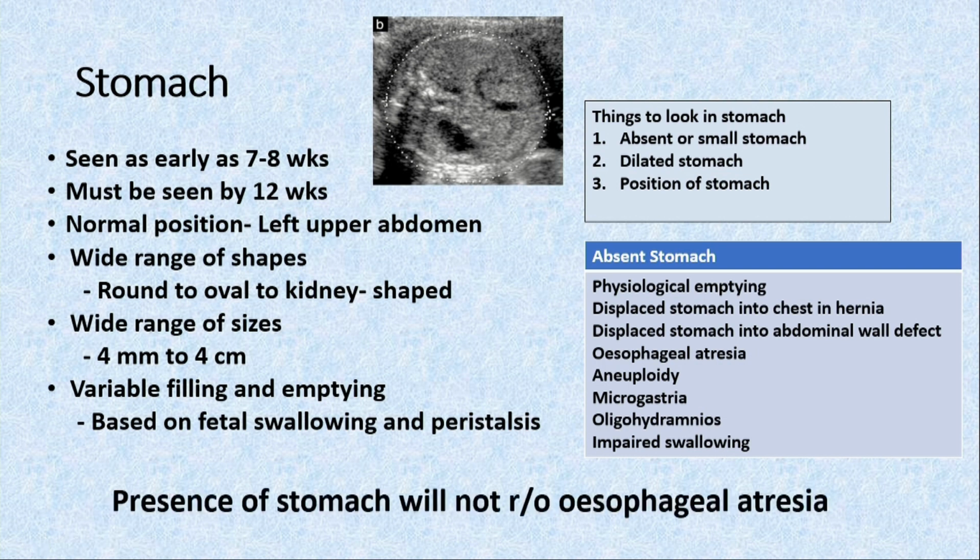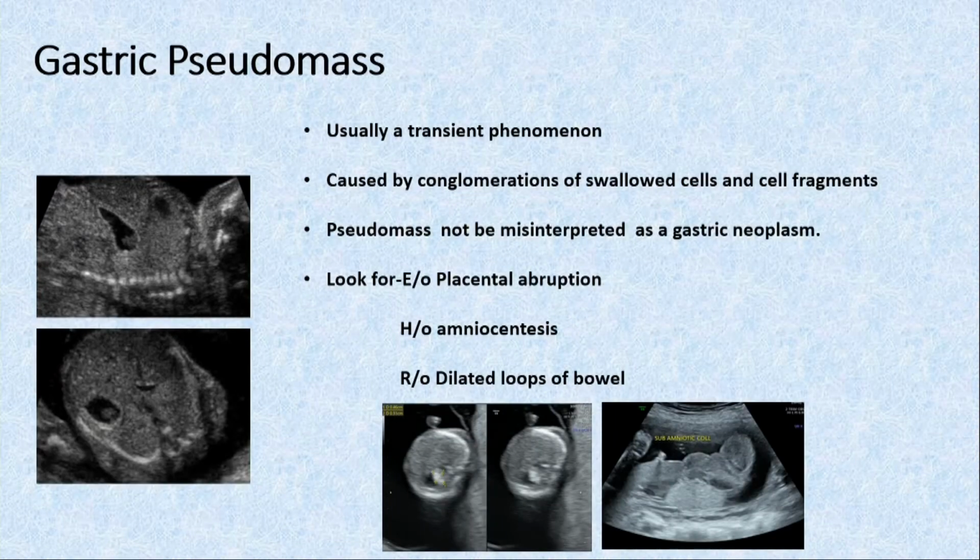absent stomach. And then also in counseling, this part should be very important: the presence of stomach will not rule out esophageal atresias.